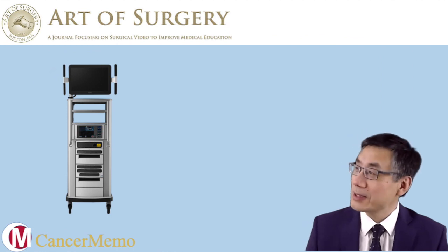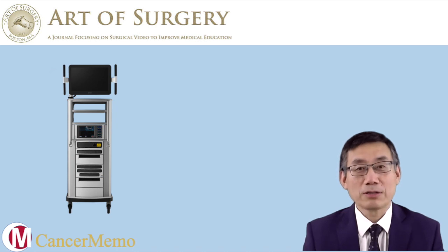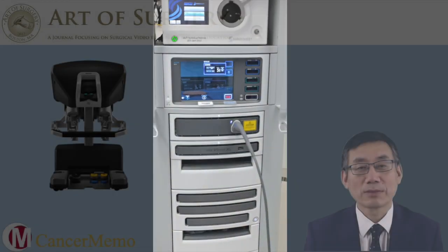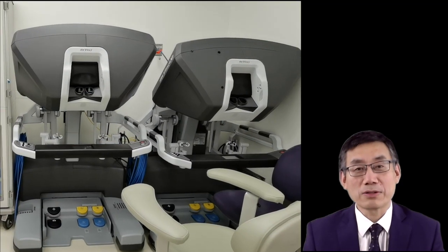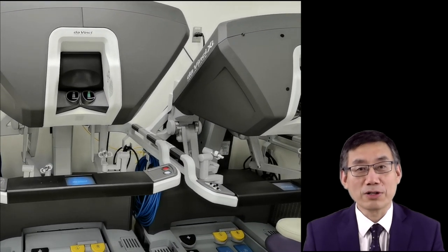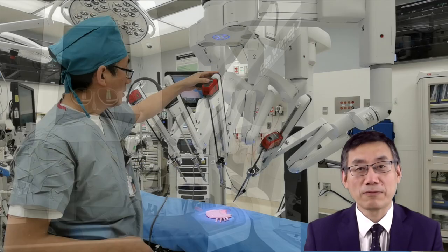The second part is the vision cart. The vision cart not only has a visual display but also carries the power supply and the gas supply. The third part is the surgeon's console, where the surgeon sits and looks through the console to control the patient cart. It has two arm controls and also foot pedals.